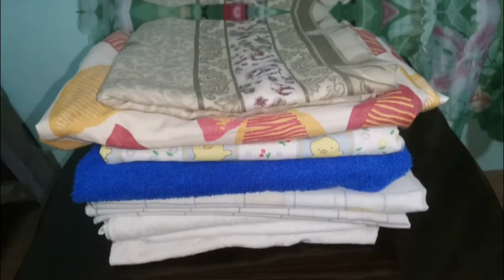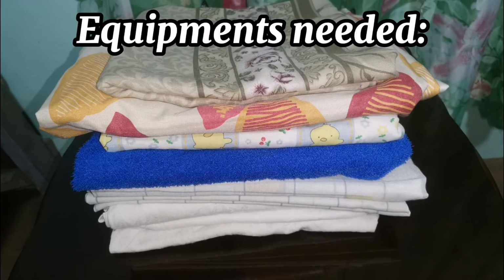I have done all the assessment and the client has the ability to reposition itself, but the assistance of the nurse is needed. Here are the equipments to be used.